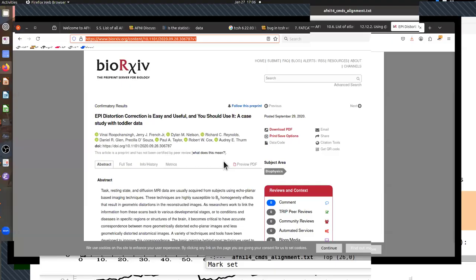Motion or distortion correction first. I think we do the motion estimation. Uh-oh, now I have to remember where the blip is. I think we do distortion first. I guess the blip distortion is done first, then the motion correction. It's kind of independent, but yeah, they're two separate calculations, really.